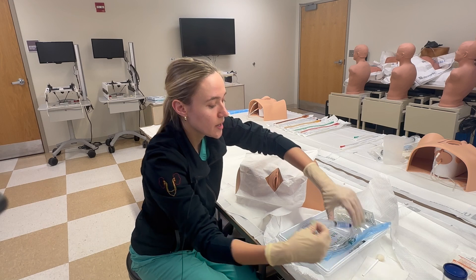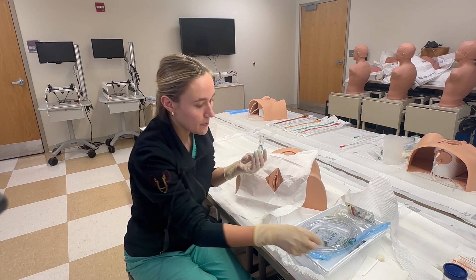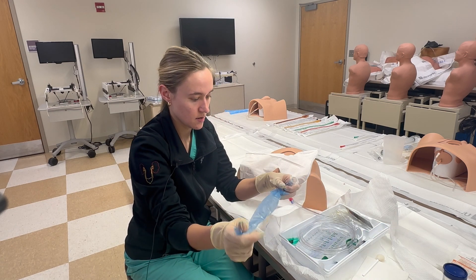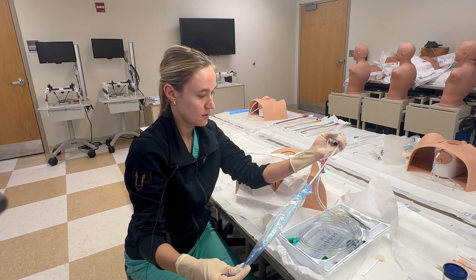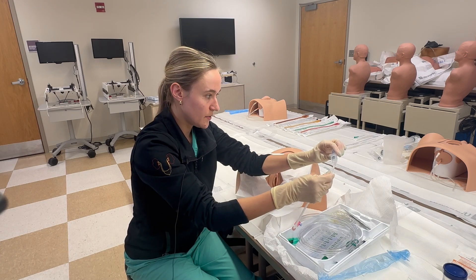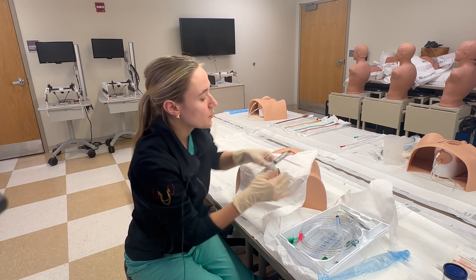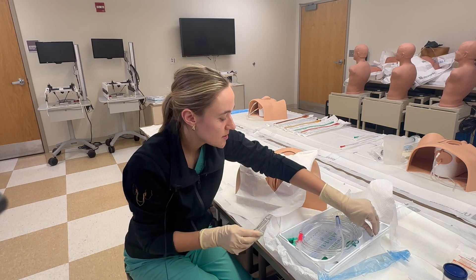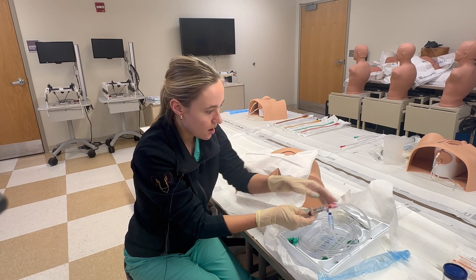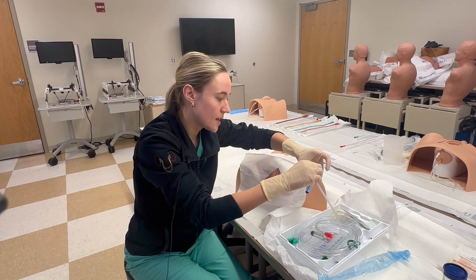Once that's done, take your lubricant — pop off the cap, then take the packaging from the catheter and put the tip of the catheter within the lubricant, just to protect it and also make sure it's well lubricated. Then take your sterile water and attach it to your Foley balloon. Now everything's ready to go, which makes things quick and easy.